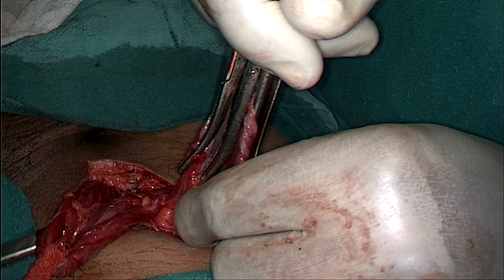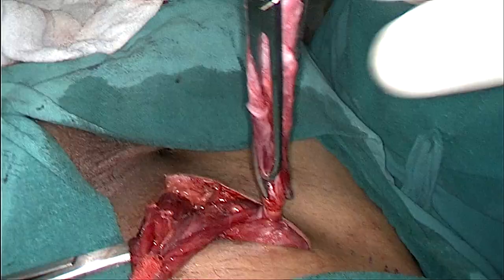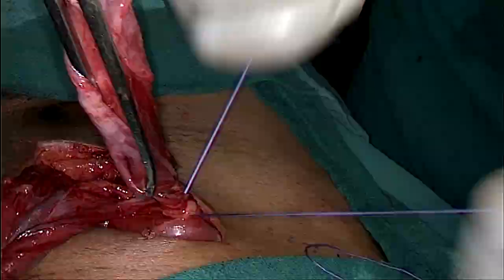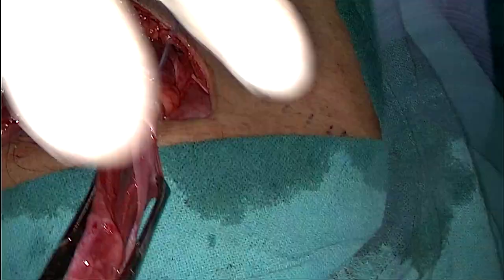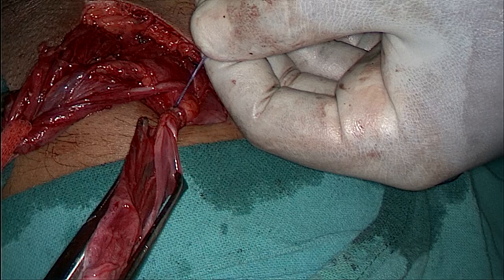Always be sure that there is no omentum or bowel just before you start the transfixation of the sac. As you can see I am rotating the sac and start transfixing it with Vicryl 2-0 — you can use Vicryl 1-0 or any other PDS. Try to avoid using catgut as the half-life of catgut is very short. And there goes the sac.